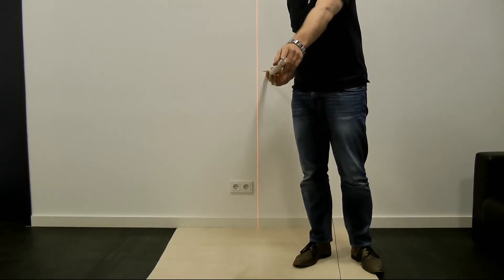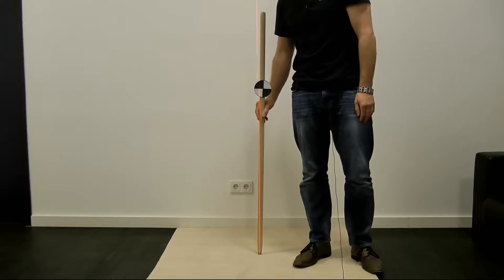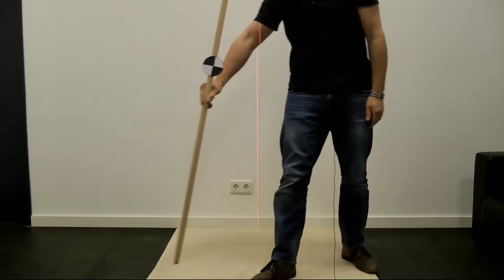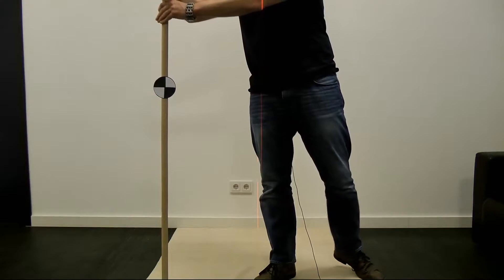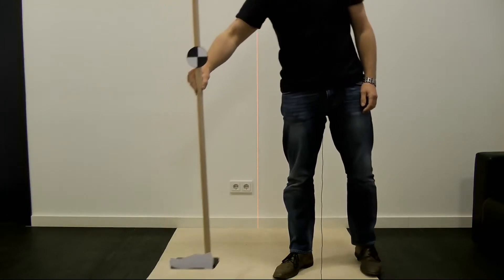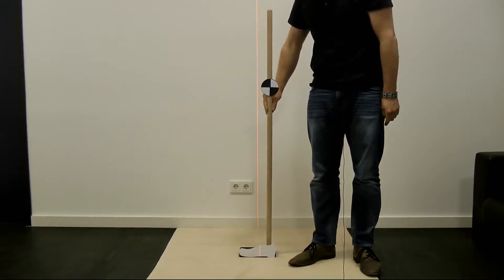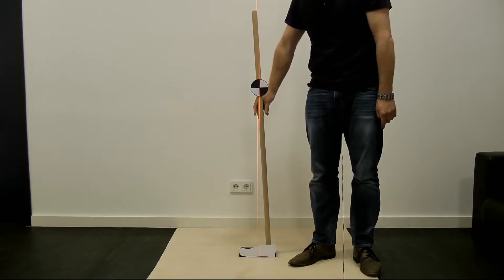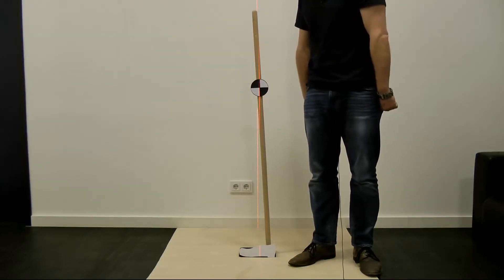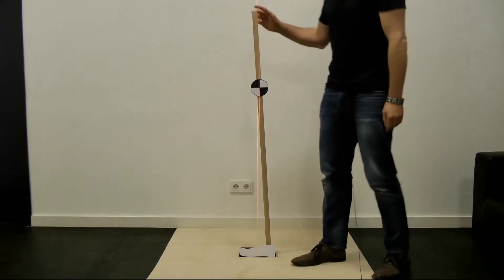The solution for this problem is obvious — we have to increase the supporting area, and that is exactly what we do. Here it is simulated by a cardboard shoe, increasing the support area available. We expect the plumb line to fall within the available supporting area, and we see that we have achieved that. The broomstick can stand stable without my intervention because we have extended the area of support, and this provides more stability.